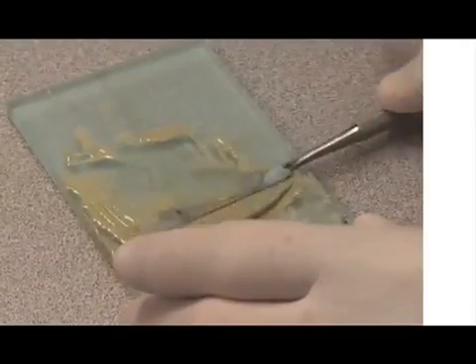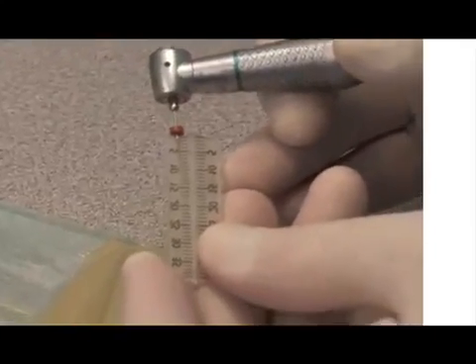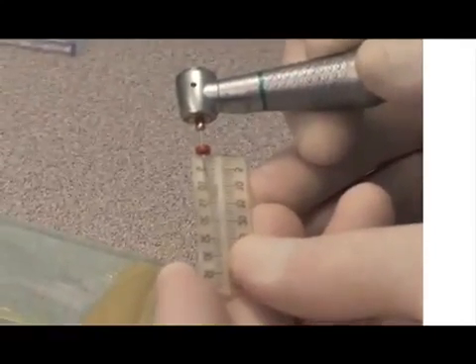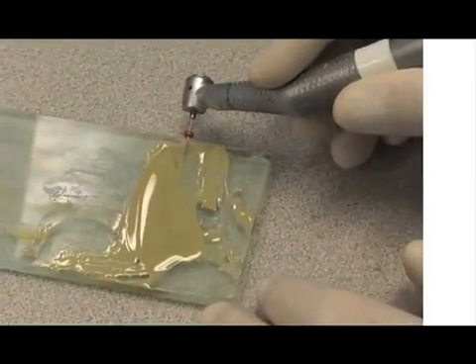Either way will work. Epoxy cements have a property where the application of minimal heat increases the flow significantly. Rather than use heat, I would simply apply more gel, but that would make the mix less radio opaque. Under any circumstances, the applied heat is minimal and the cement, when applied to the canals, is cooler than body temperature, meaning it will expand a small amount as it warms to body temperature.